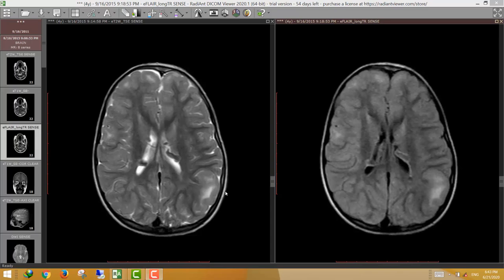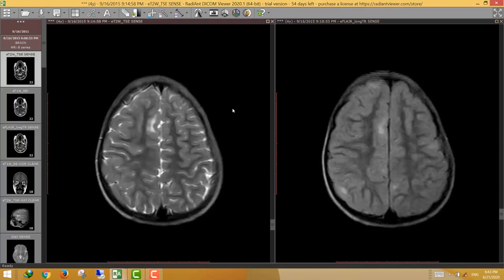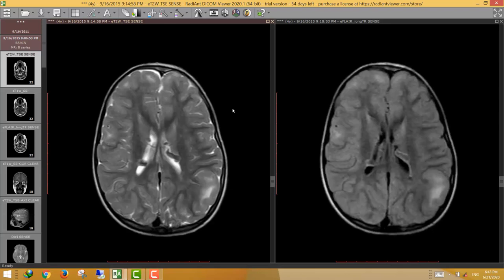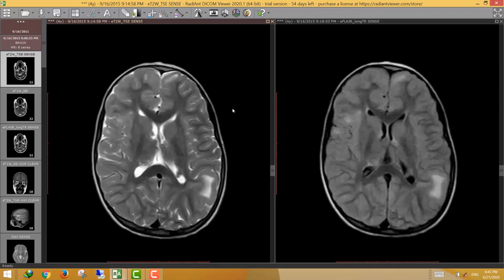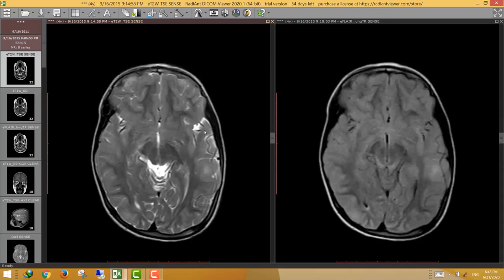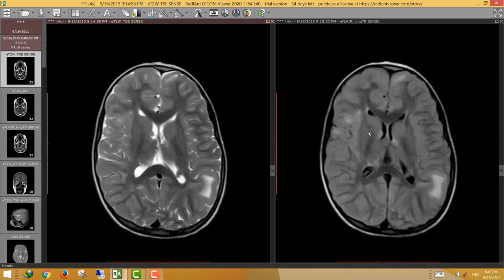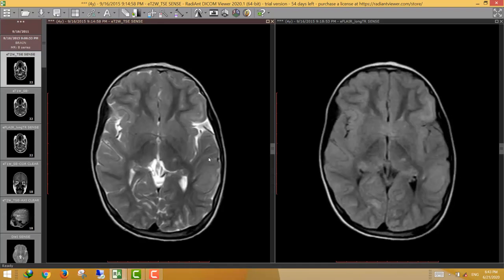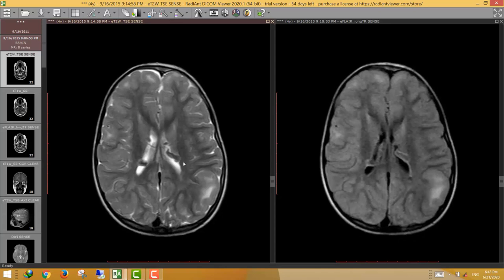Bismillah ar-rahman ar-rahim, assalamu alaikum warahmatullahi wabarakatuh. Welcome to a new session from a film reading session. As usual, we start with a neuro case. This is a four-year-old boy who came for doing MRI brain. These are the T2-weighted images and the FLAIR-weighted images.